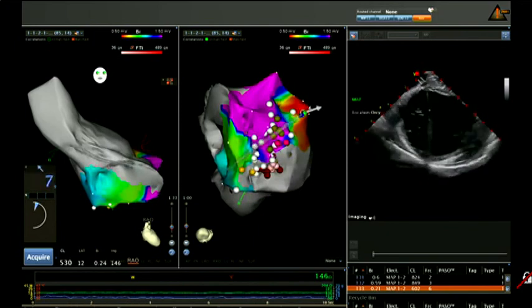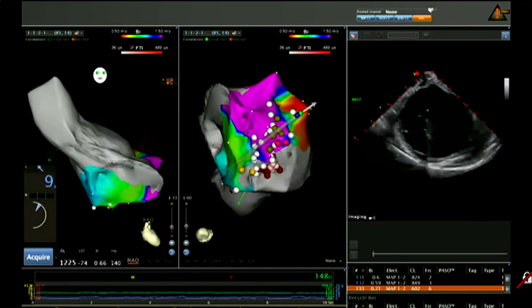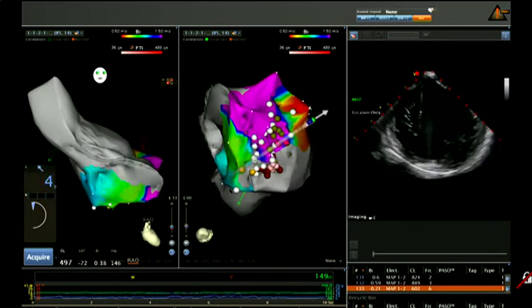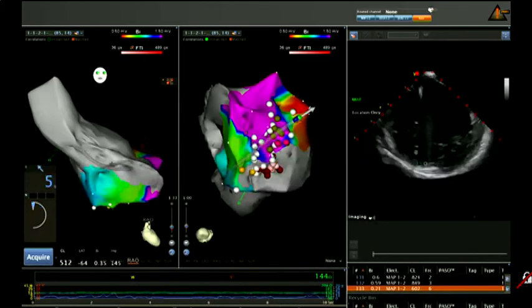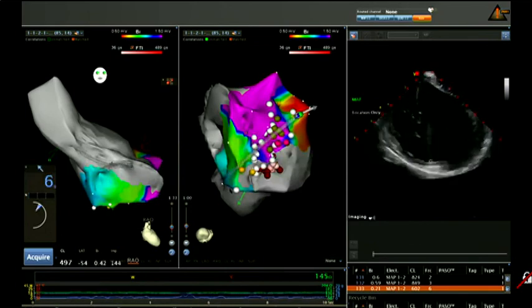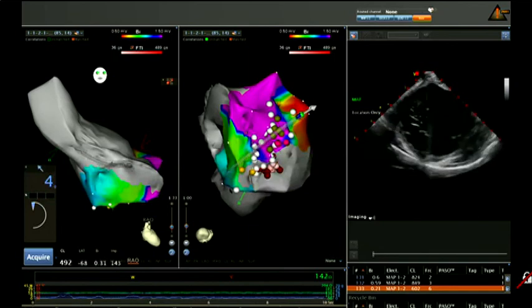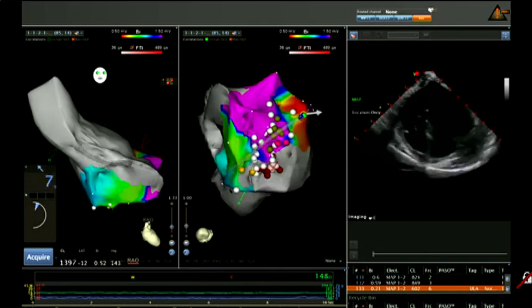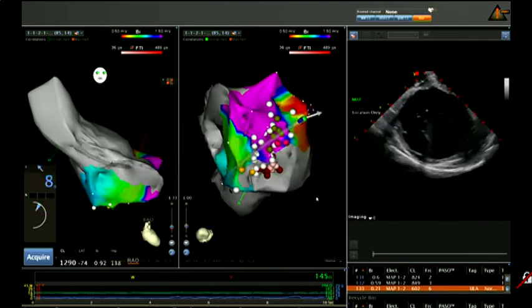We recorded an increment in blood pressure, but it's not too much. We still continued dobutamine. The effect of the dobutamine is still present, apparently, even though we stopped the dobutamine maybe 7 minutes ago. So it looks interesting to map PVCs.